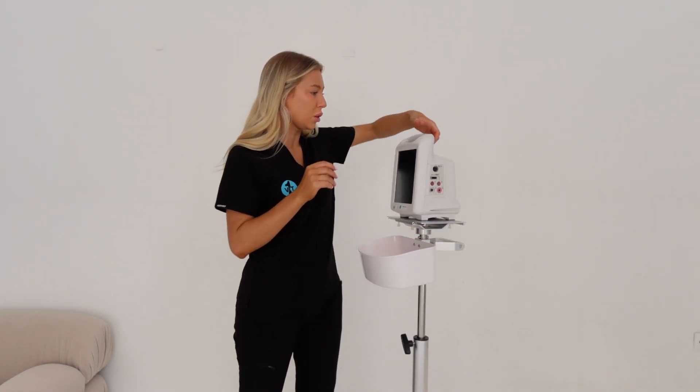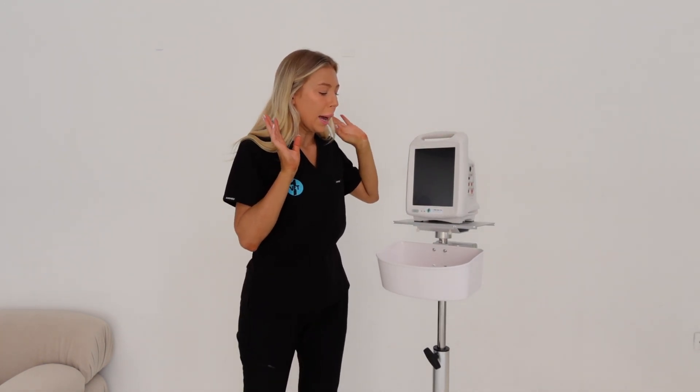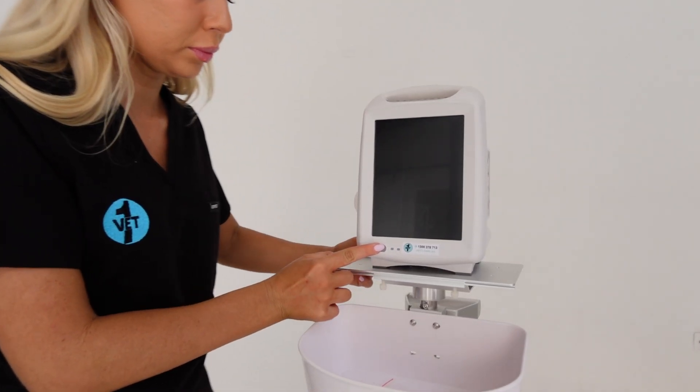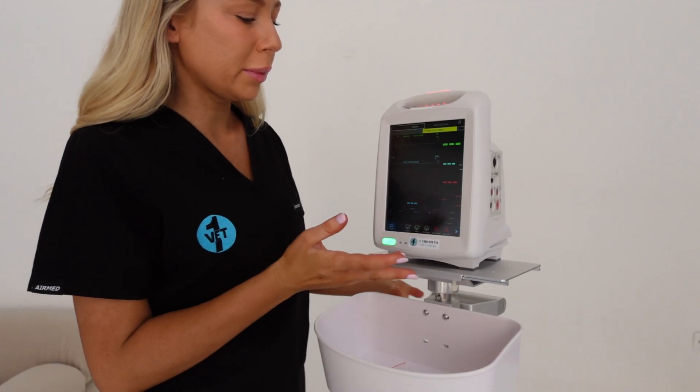I like this monitor because it's nice and small, it's got a handle on the top, and it's just nice and easy - not too bulky. I'm going to show you how it looks when you turn it on in demo mode.